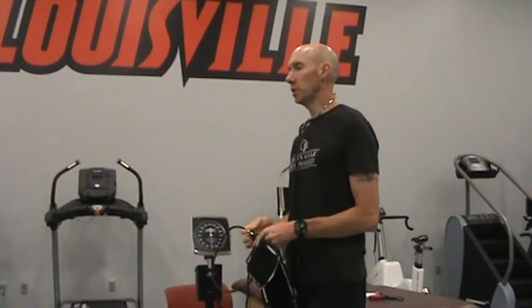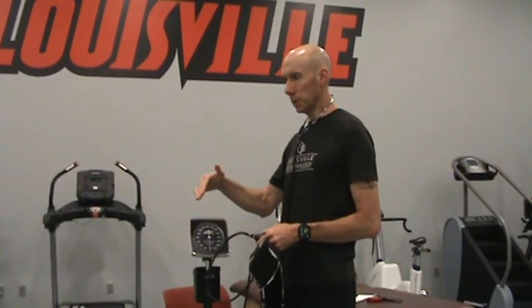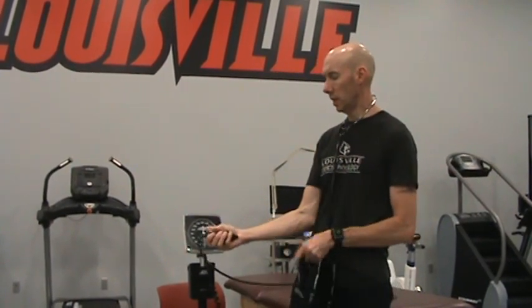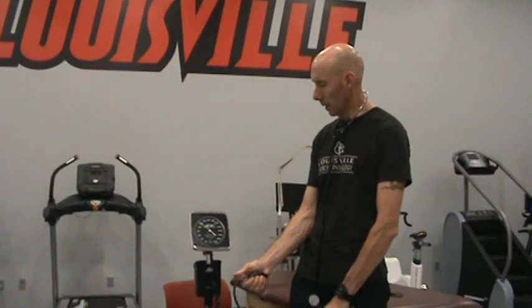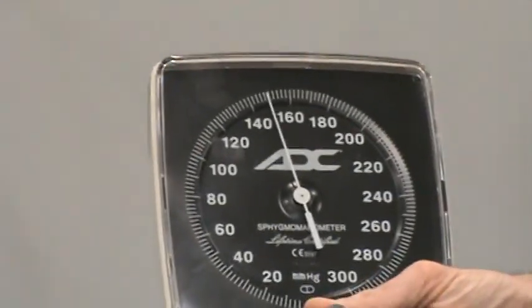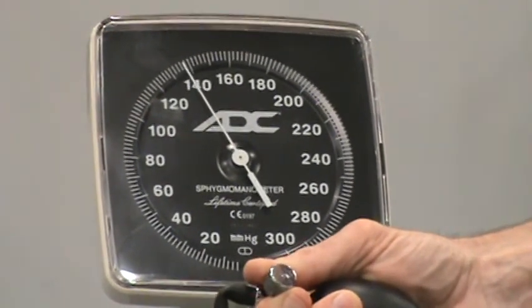What we often aim to do is pump up the pressure at the beginning 20 to 30 millimeters of mercury above the anticipated blood pressure, or around 150 millimeters of mercury for the average person. Okay, so I would close the valve, pump this up to around 150 to 160. Then I'm going to immediately open the valve and let it drop very, very slowly.